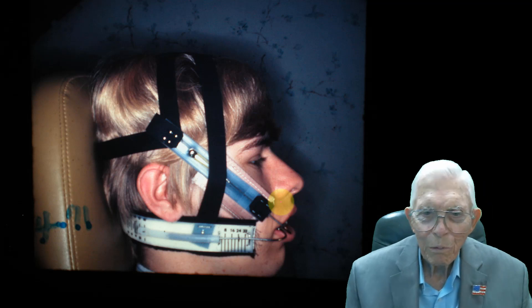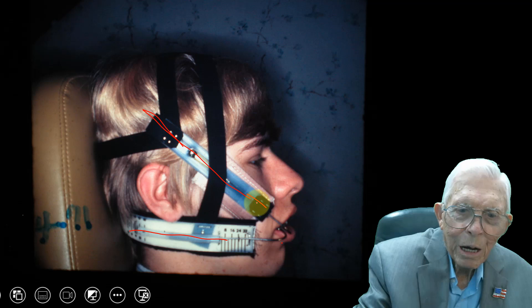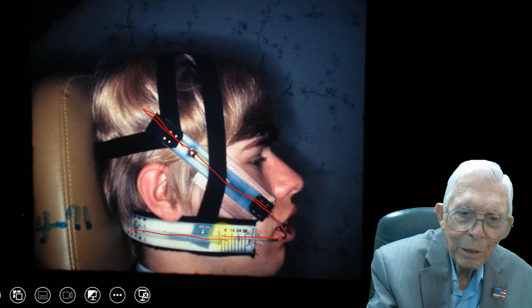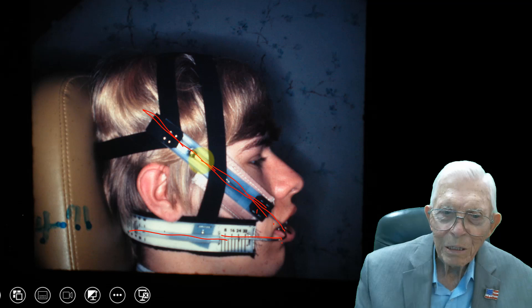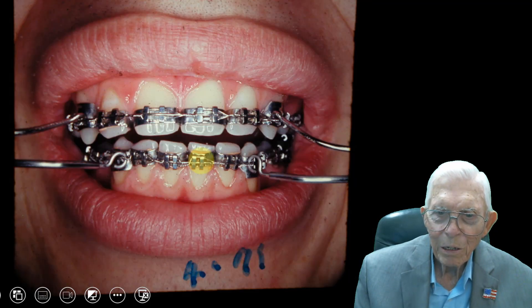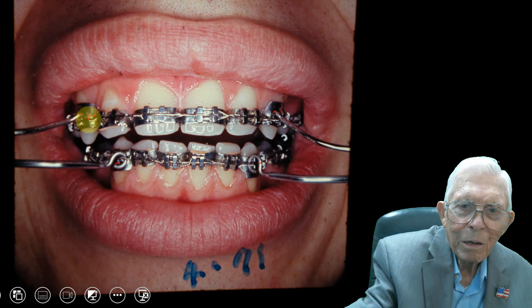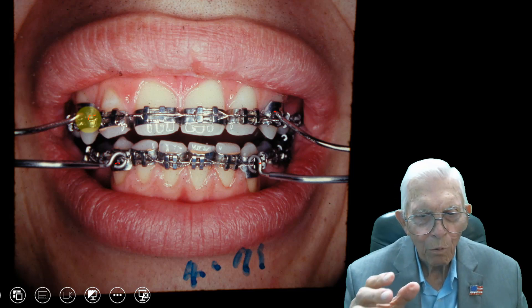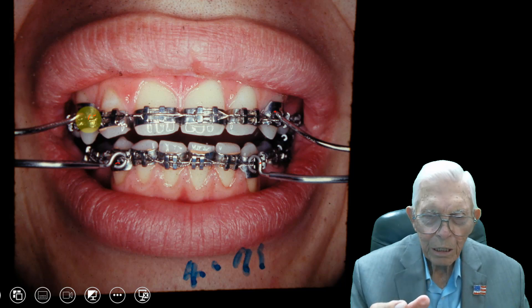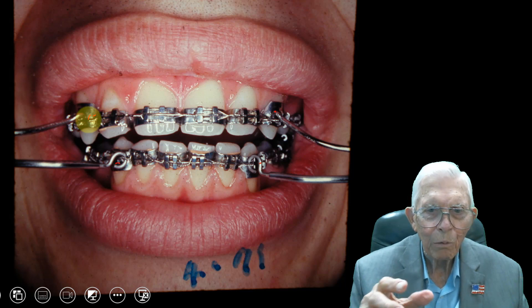This is what we would call a cervical headgear, and this is an occipital type headgear. So this one is bringing it back, and this one is bringing the upper teeth up. We were hooking these into the braces, and so you can pull the teeth. Headgears are nothing in the world except a way of putting pressure on teeth to move them in certain directions, and headgears will work 100 years from now.